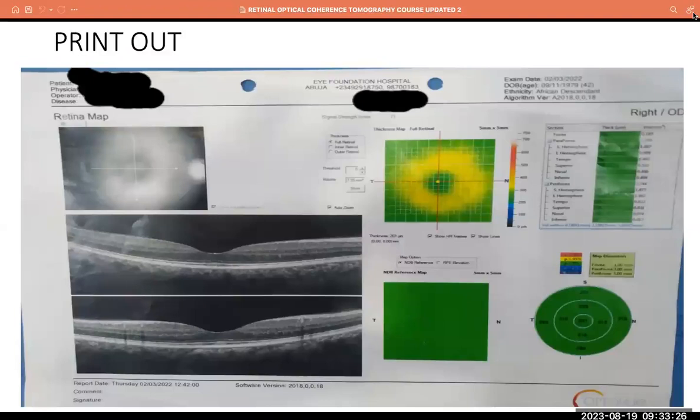However, you have to put this in line with your patient. Several patients may have fixation difficulties, okay, and that may make the scanning long, tiring, and the signal strength may actually be poor. So at this point, you have to put both the history of the patient and the examination findings together while making your decision.